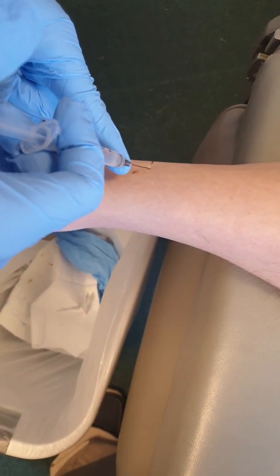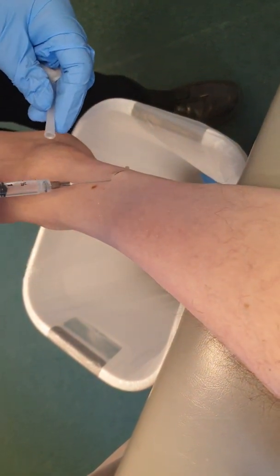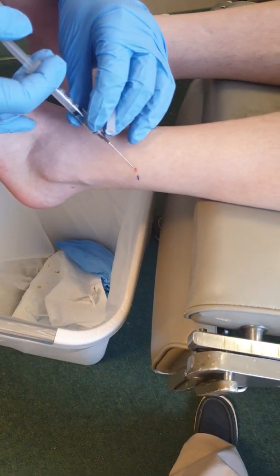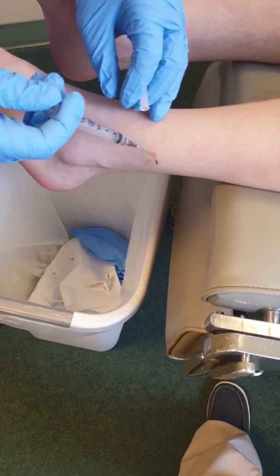I'm just going to raise up a wheal, and that's it really. Do you feel that at all? Yes, you felt a little bit. How about now? Not so much — right there, okay good. I'm raising up a wheal in the area, that's all.